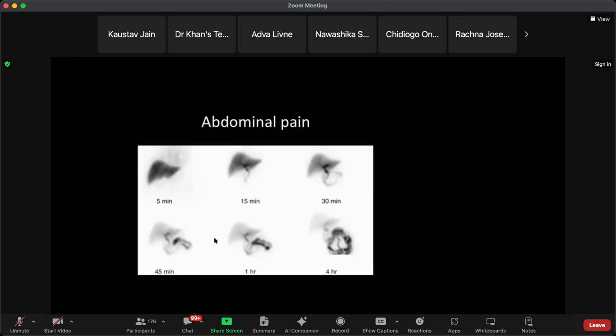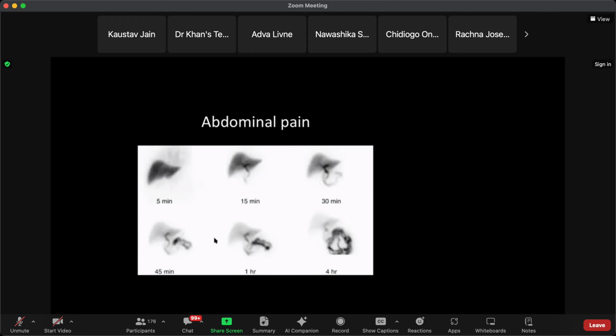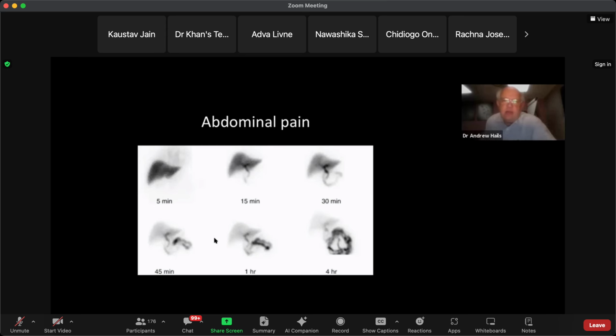The gallbladder? Yeah. Now, assuming the patient hasn't had a cholecystectomy, which of course is sometimes a big assumption in the hospital, isn't it? But why have they got abdominal pain? They've had some other form of abdominal surgery, maybe a resection, and everything's plumbed in abnormally. No, the answer really is because there's a stone in the cystic duct, so the HIDA can't get through to the gallbladder.